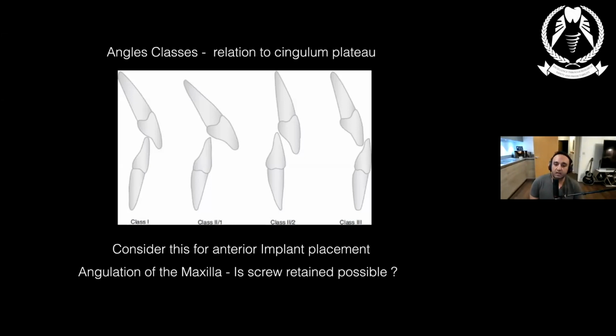The main thing I have the issue with cement retained is labs putting the junction too deep down into the tissues. So if you have thick biotype, you place your implant quite deep, and they put their margins even deeper. You're not removing that cement, and you're going to get cementitis and repeated problems. So that's the main kind of issues around this.